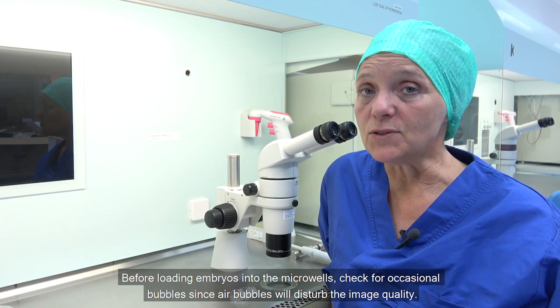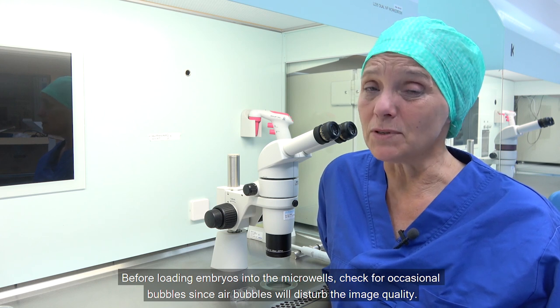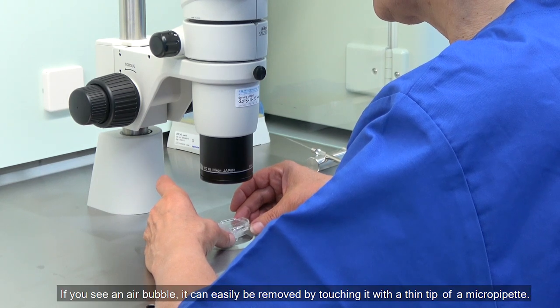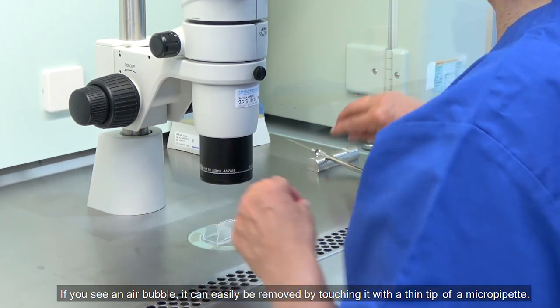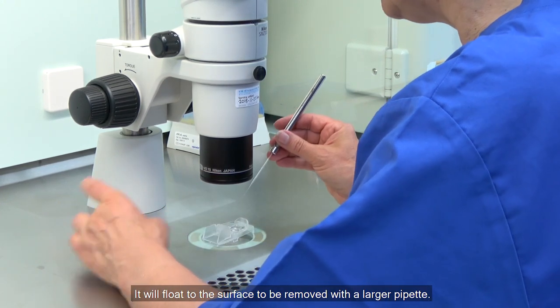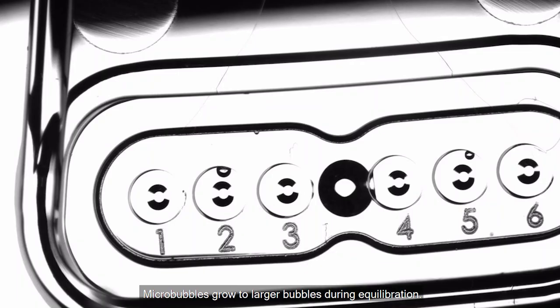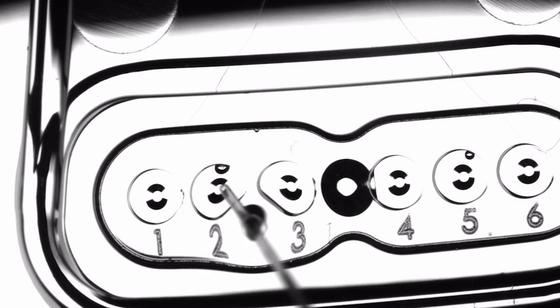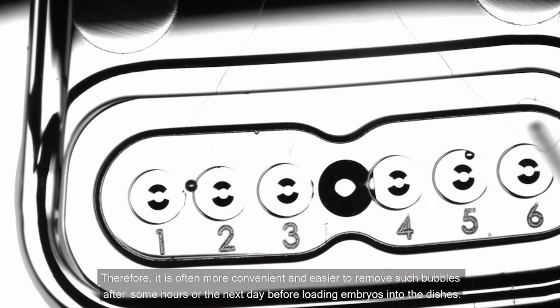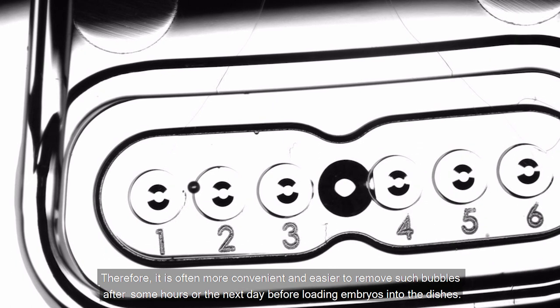Before loading embryos into the micro wells, check for occasional bubbles, since air bubbles will disturb image quality. Remove any bubbles by touching them with a thin tip of a micro pipette — they will float to the surface to be removed with a larger pipette. Micro bubbles grow to larger bubbles during equilibration, so it is often more convenient to remove them after some hours or the next day before loading embryos into the dishes.